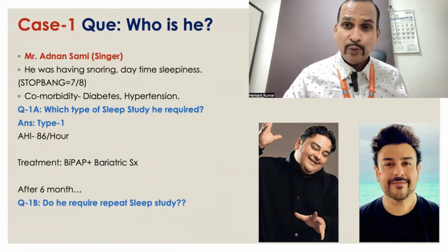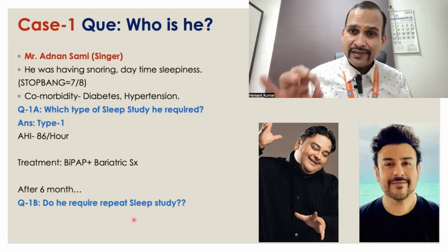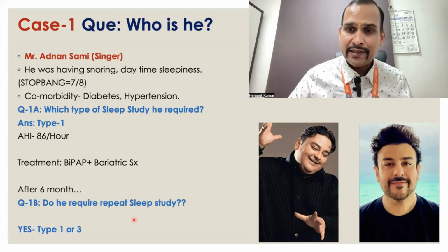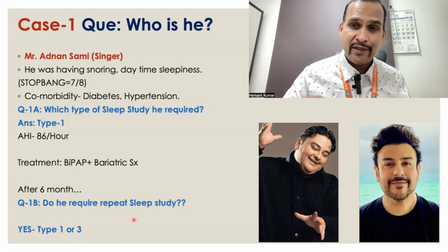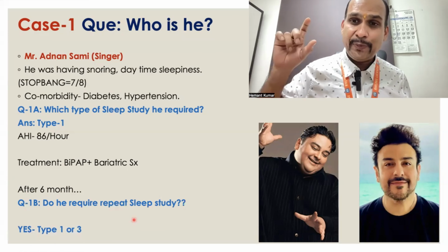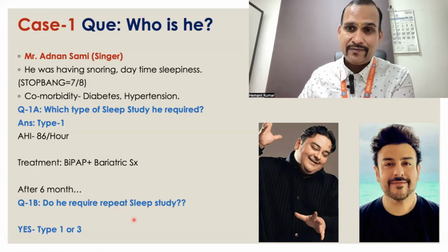Okay. So my question to you is whether he required a repeat sleep study or not. Okay. So the answer is yes, definitely. As I told you earlier, the American Academy of Sleep Medicine recommends that if some patient lost 10% weight or gained 10% weight, we have to repeat polysomnography to say the actual AHI.